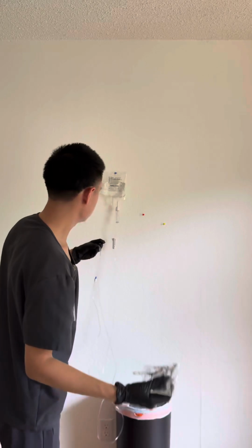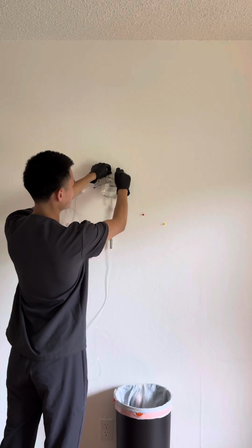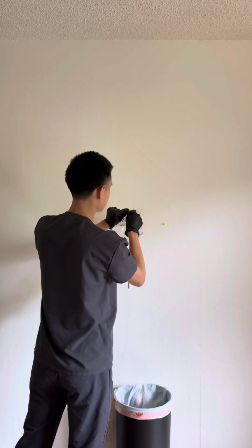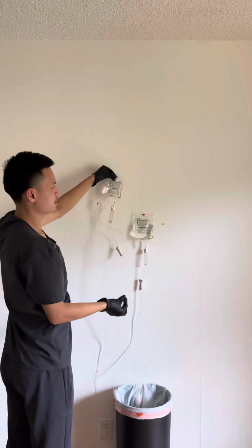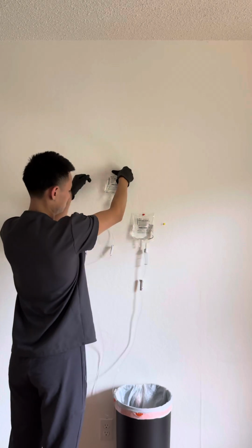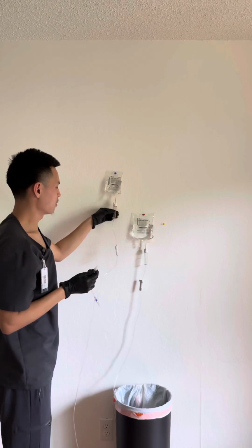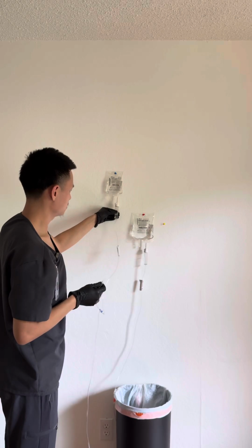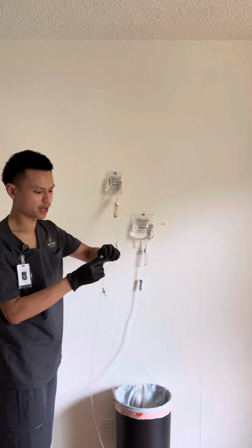Okay, make sure that's connected. For my primary tubing, I'm going to make sure that it is lower. And then I will hang the medication higher than the fluid. Once that's connected, I will now squeeze the chamber halfway so that fluids can fill. Okay, so that's about halfway filled. I'm going to remove the cap to the secondary tubing.